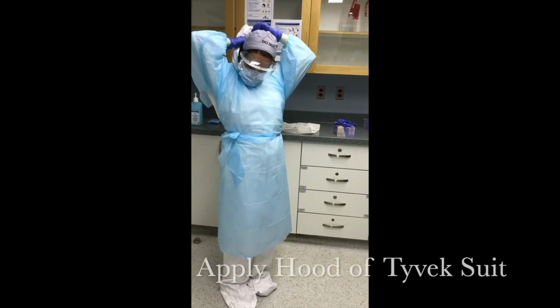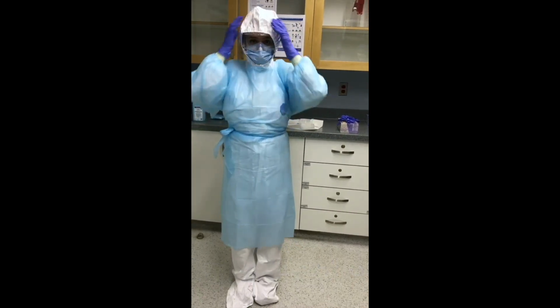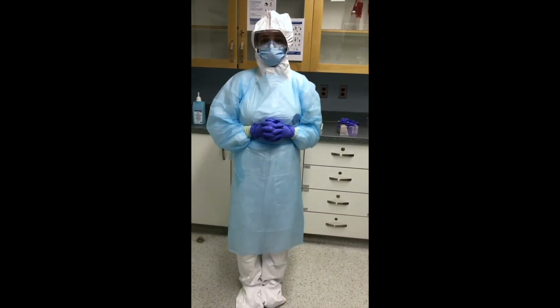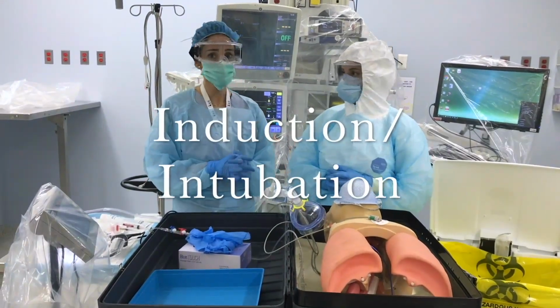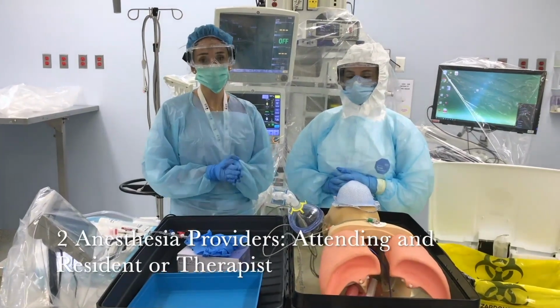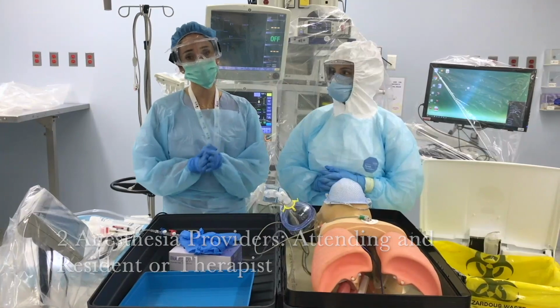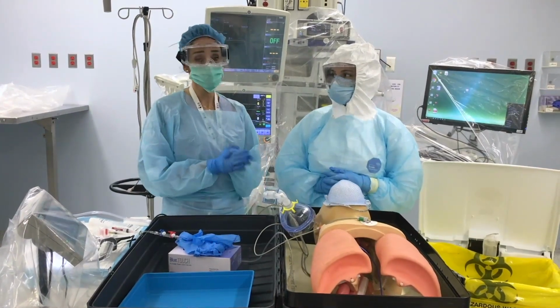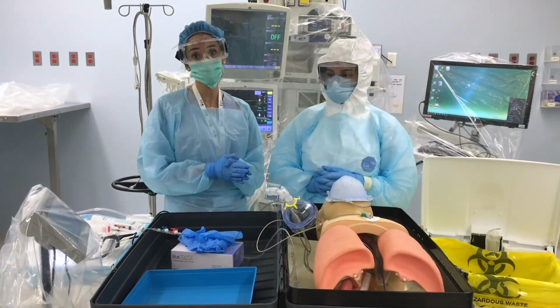Make sure your hands are covered and all your face is covered. And now you're ready to go. Okay, so now that we're ready to induce, we're going to ask all the personnel in the room to step out. Only the anesthesia attending and the anesthesia resident are going to stay in the room during intubation and extubation. Please assume that both of us are going to be wearing full personal protective equipment during these two steps.